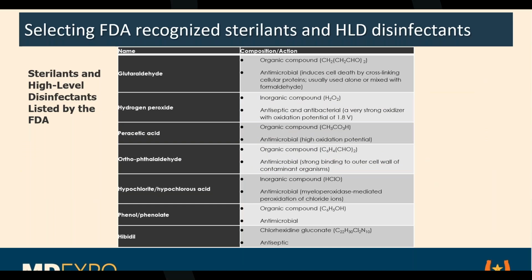And sometimes it's irreparable damage. I'll show you again a couple of examples of that, but you have to go through all of those things, not only the chemical, but also the protocol that the chemical manufacturer puts on there.